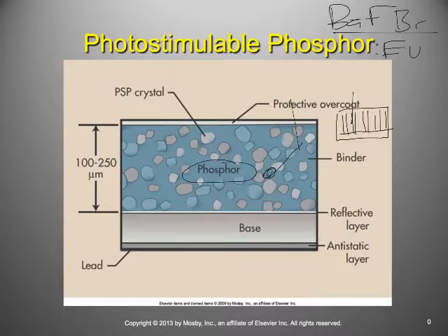Moving along here. Oh, one other thing I want to look at is down here. This is kind of important stuff too. So the main significant thing here is, within the PSP, the main thing that we've got is what we will call SPSs, right? These storage phosphor screens.